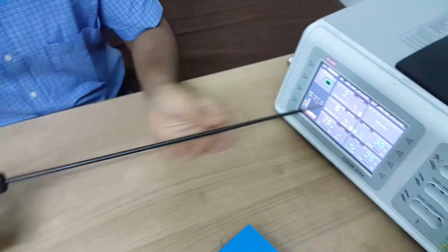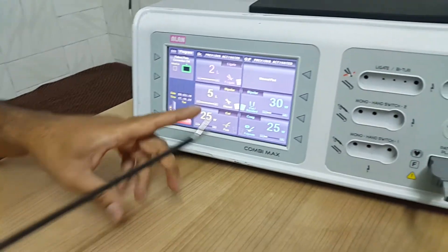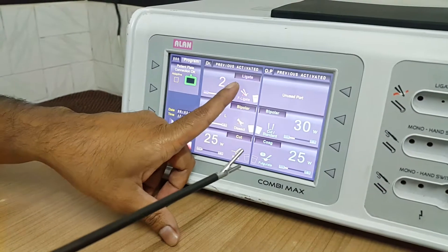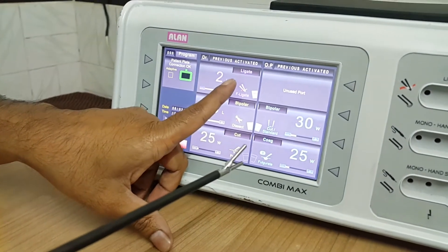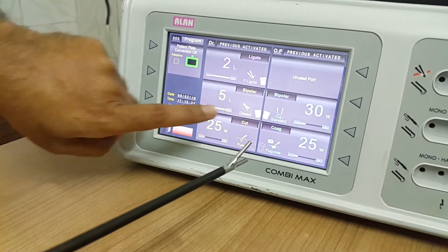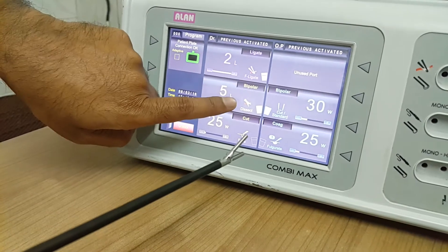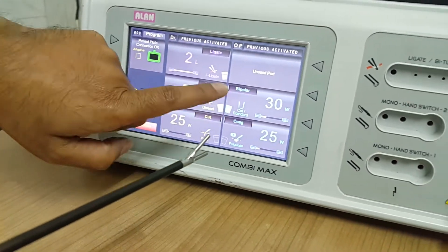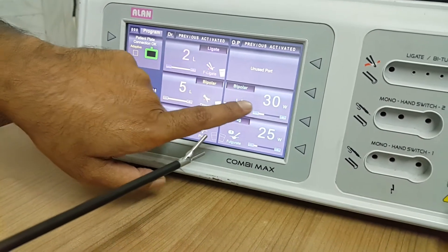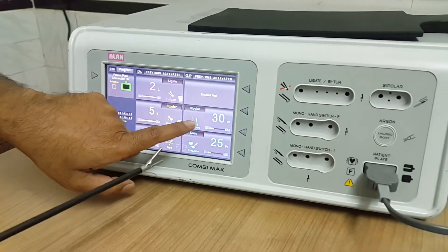To use this instrument at its full efficiency, you will need three modes. One is ligate — to seal the vessel. And immediately after that you can use dissect mode, which is a specially designed mode to cut the vessel after sealing. Then if you don't need those two modes, you can use a simple bipolar mode for coagulation of bleeders.